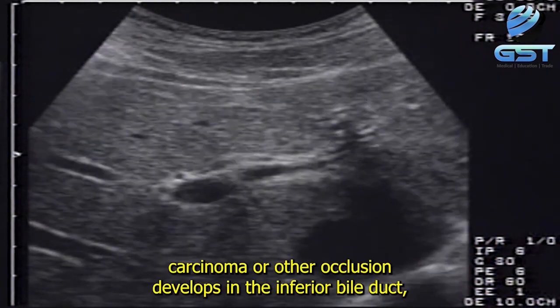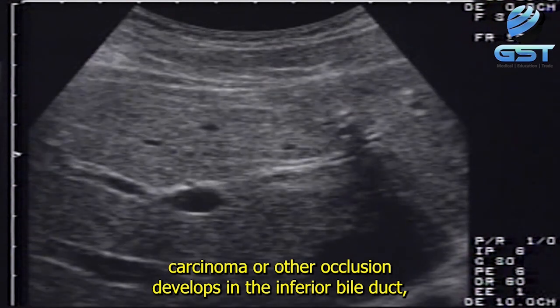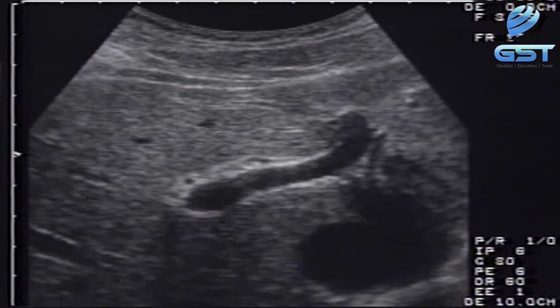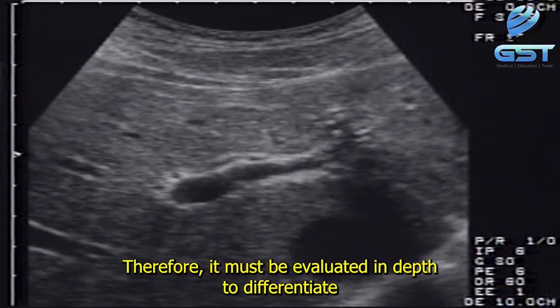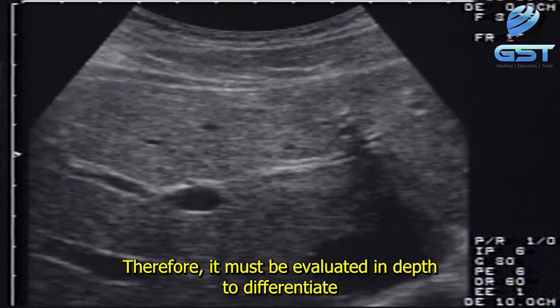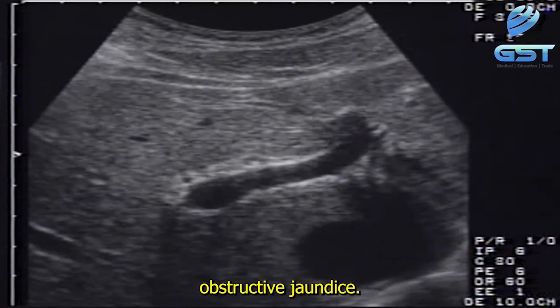If a calculus, carcinoma, or other occlusion develops in the inferior bile duct, the left hepatic duct is the first to become dilated. Therefore, it must be evaluated in depth to differentiate obstructive jaundice.